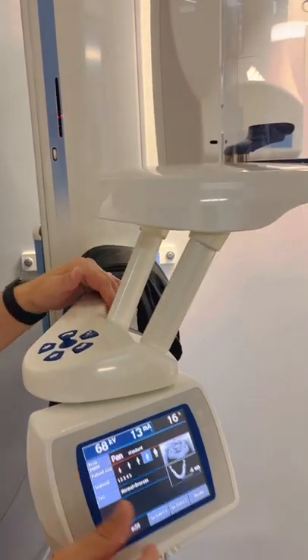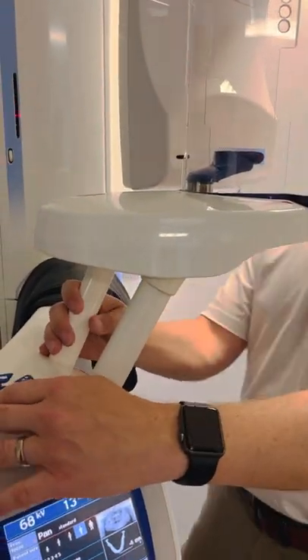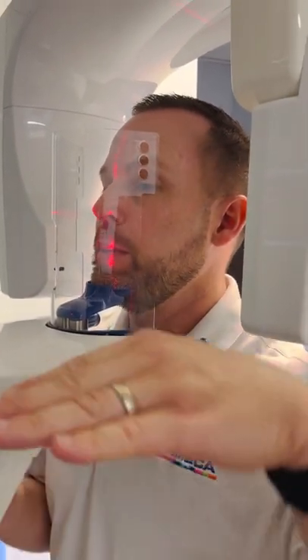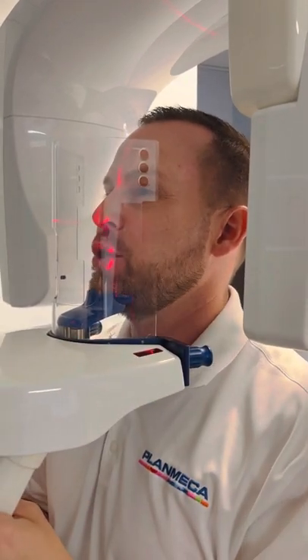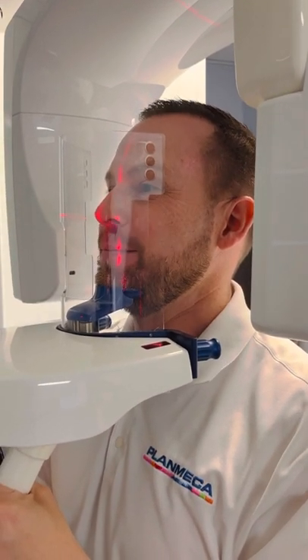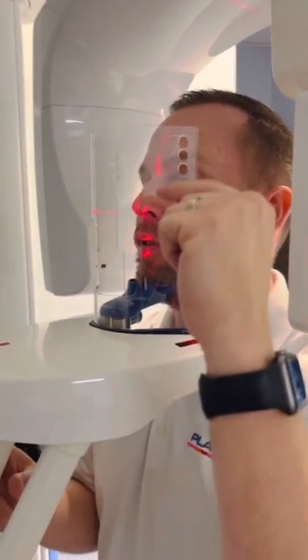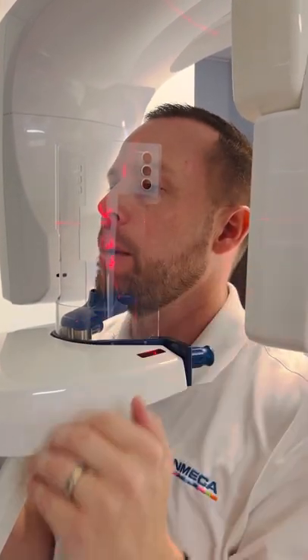I recommend adjusting the patient so their occlusion is flat to the ground — more horizontal. For panoramic it'd be tilted slightly down, but for 3D CTs have it more horizontal. That levels the anatomy in the CT so you get the maxillary roots properly. If it's not level, you're going to have problems capturing the sinus and upper roots adequately.